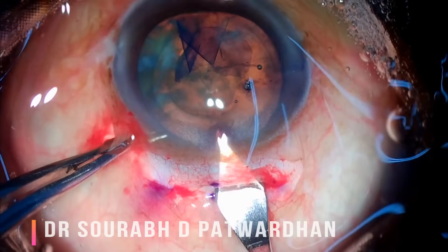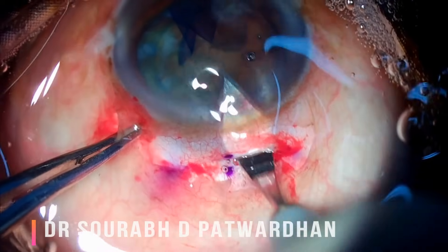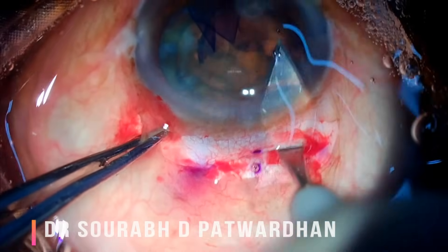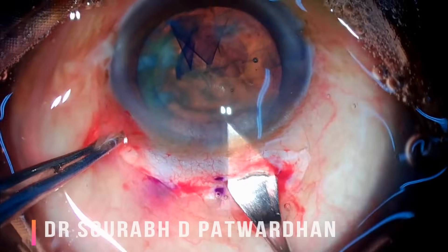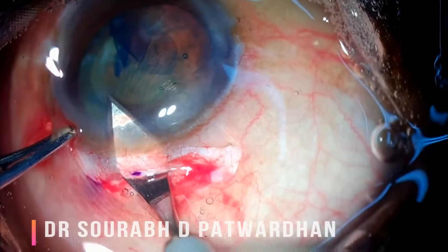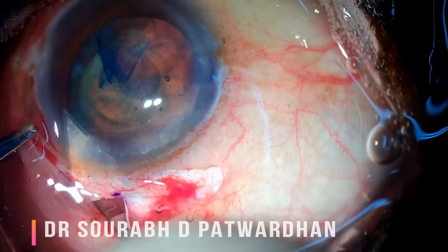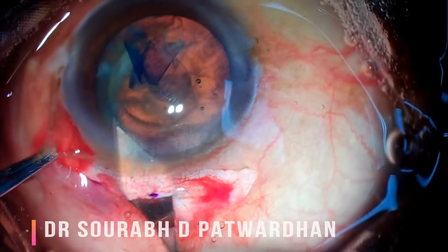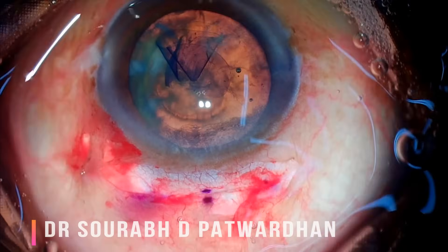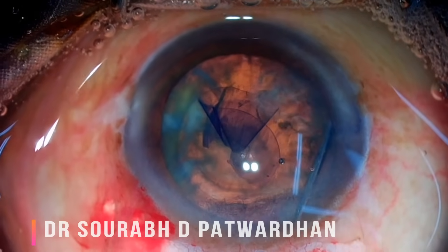While entering, make sure you make a sideward movement to ensure that your keratome is in the right plane and you are not creating another plane. Watch these movements again. See how I am cutting while entering and not while coming out — that makes the incision very regular. Also note that the inside incision is made parallel to the limbus.